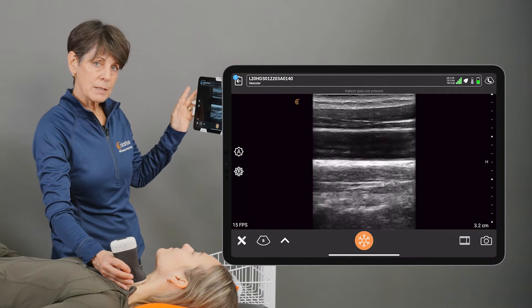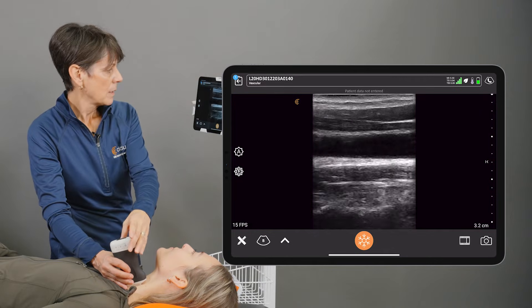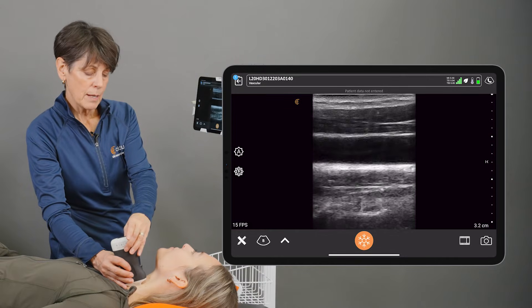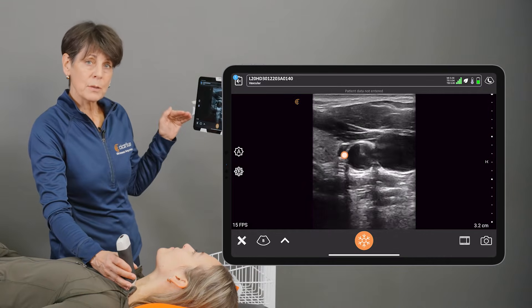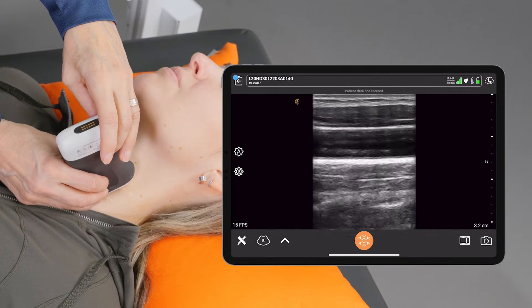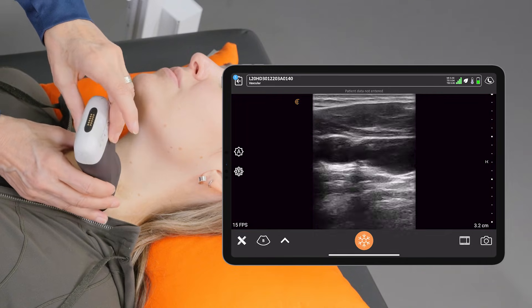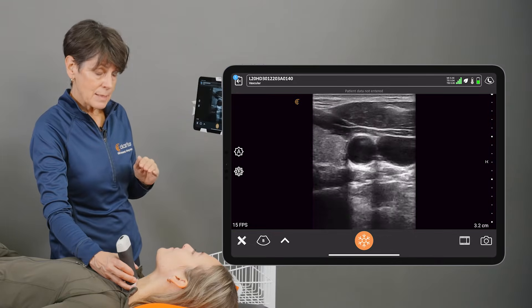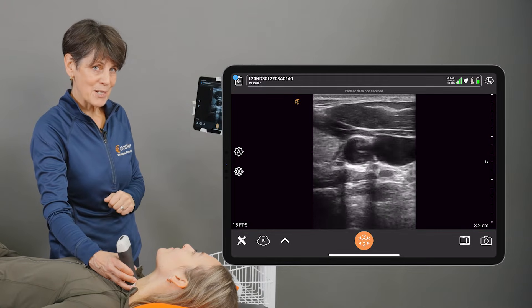The next thing we'll talk about is rotation — we're rotating the scanner to get a different view. Right now I'm looking at that carotid artery lengthwise. I'm going to rotate the scanner 90 degrees so we're going to see it in cross section. A 90-degree rotation to see it lengthwise, and then a 90-degree rotation counterclockwise to see a cross section. It's really helpful to practice this while you're watching the screen, and pretty soon you won't have to watch the scanner and your hand anymore.